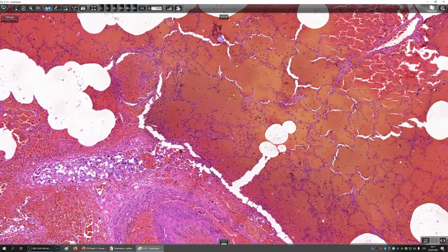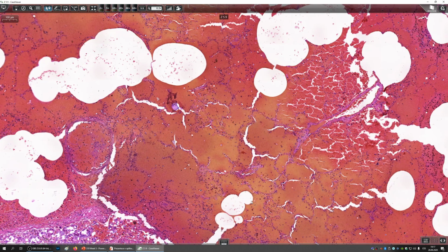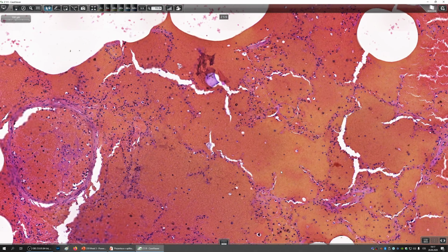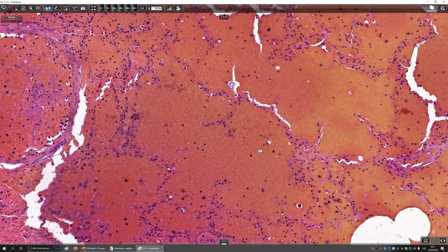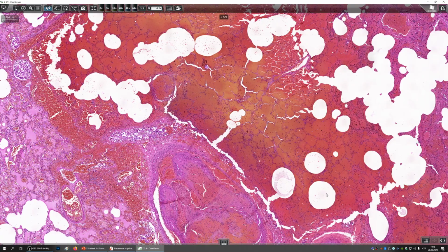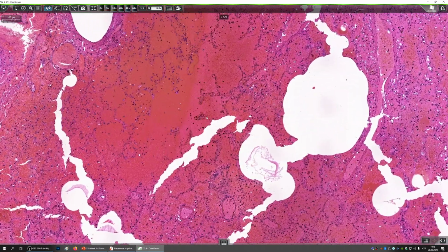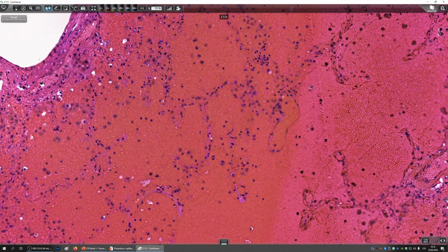If we check out, you see that this is a hemorrhagic infarction, which is a subtype of coagulative necrosis. You see that there is very, very heavy hyperemia. The blood has totally engorged the alveolar spaces and everything. This is relatively fresh and everything is already dying. So this lung infarction happened quite recently because the cells haven't lost their nuclei yet, but they are on their way out. Here you see some leftover ghostly outlines of the alveolar septa.